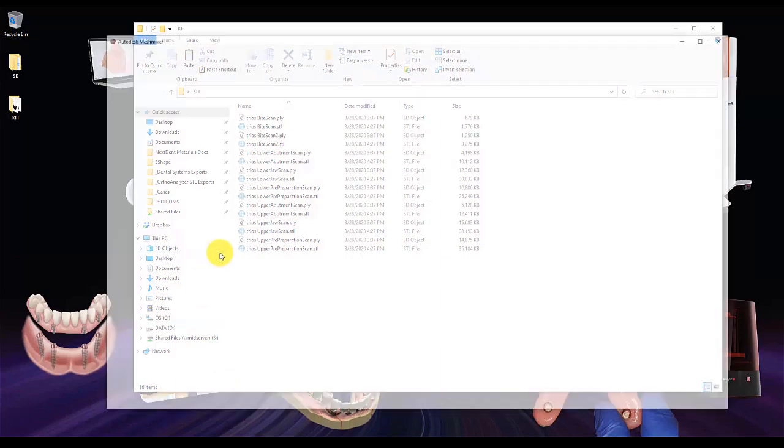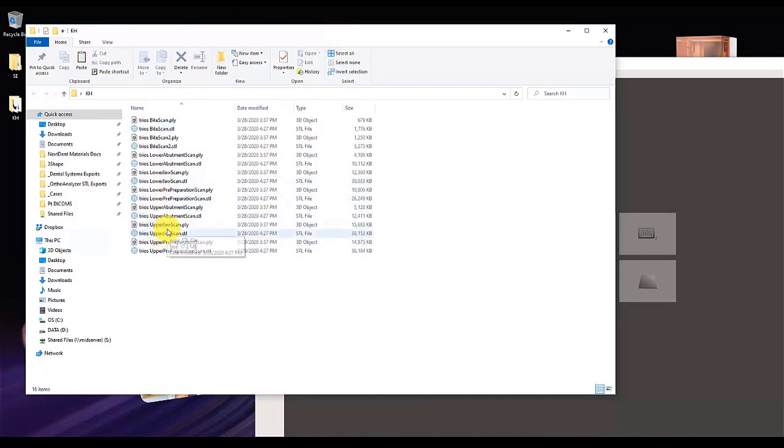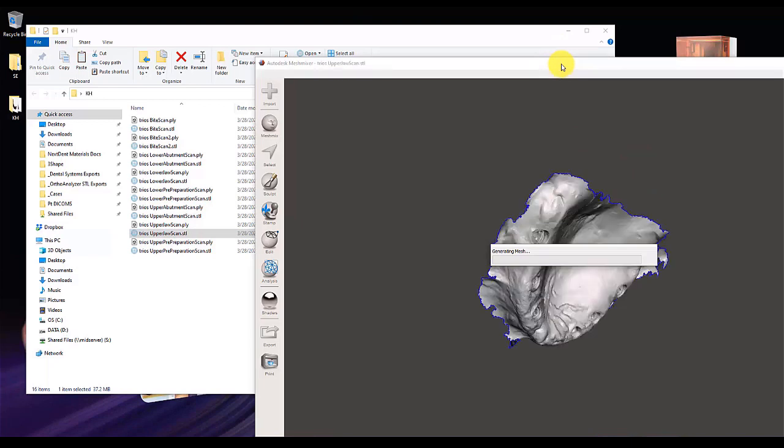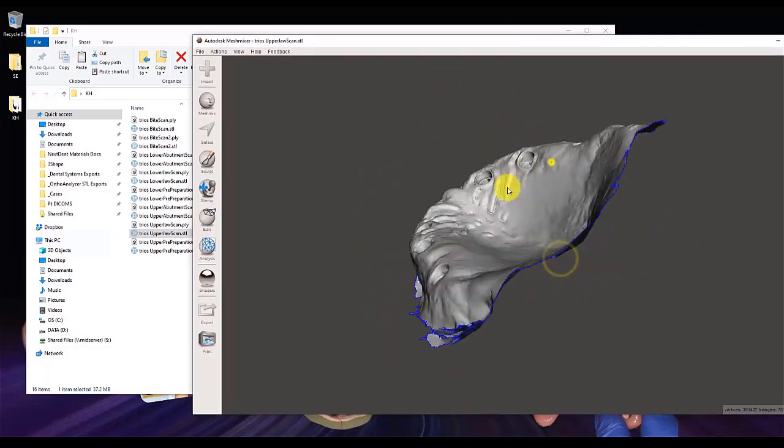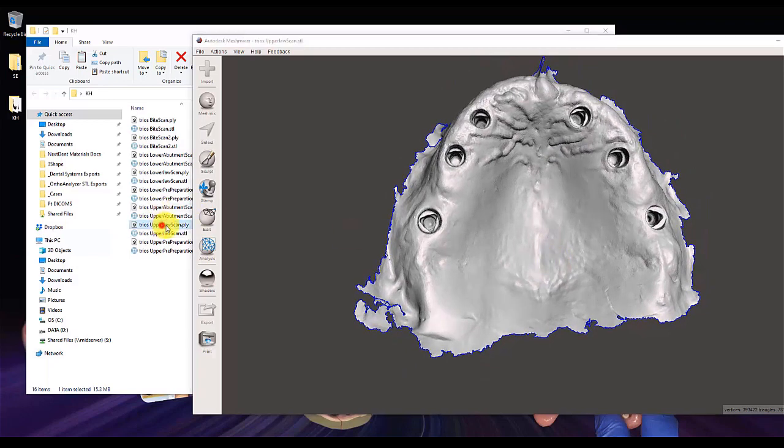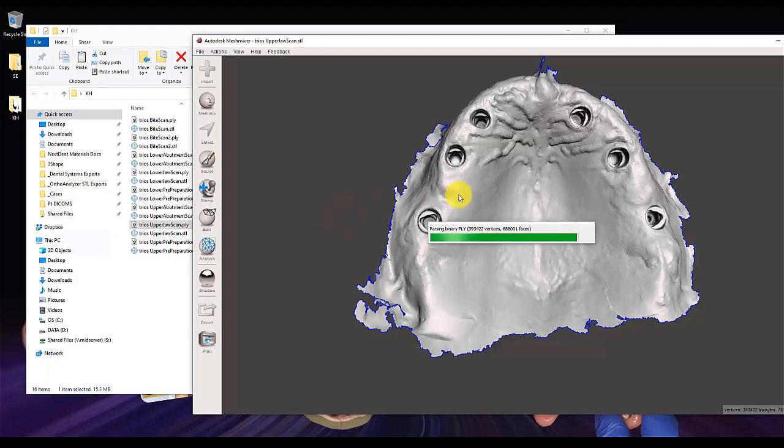I'm going to go ahead and open up a MeshMixer application, and let's drag in our upper jaw scan. So I'll bring in the STL file format of this patient. And here's our STL file. So it looks pretty good, looks pretty clean. Let me go ahead and drag in our PLY, and I'm going to append it to MeshMixer, so that way I can compare the differences between the two.